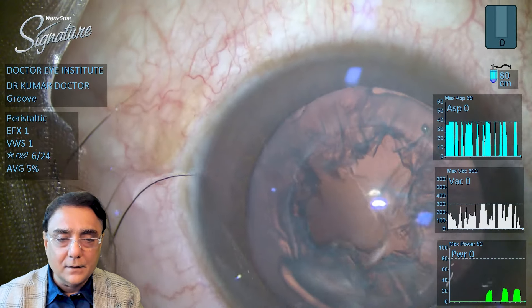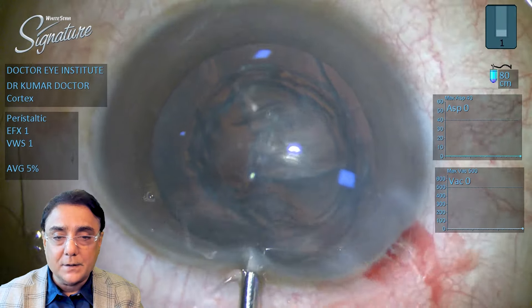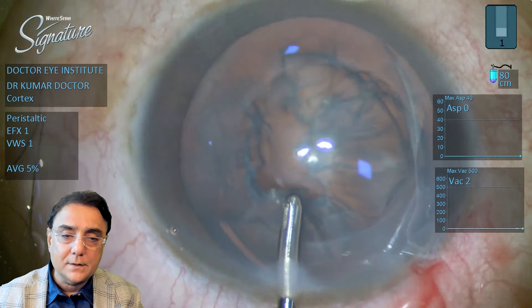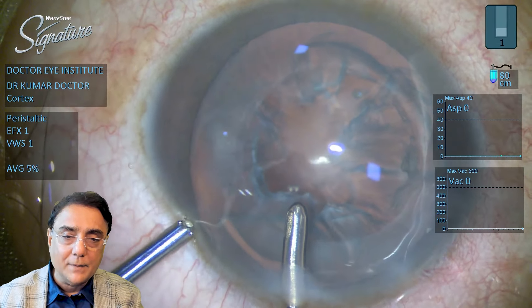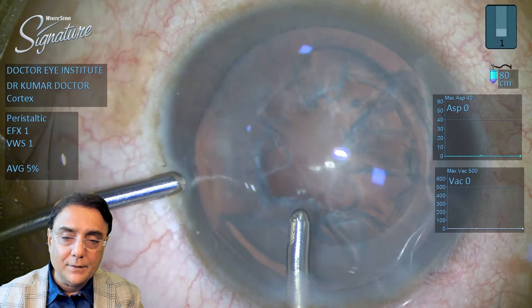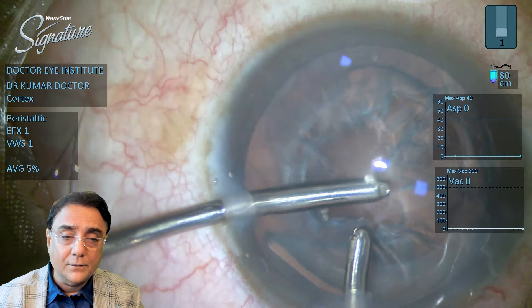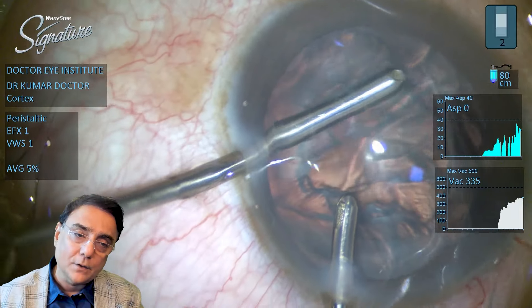Once that is done, one has to go ahead to do the bimanual IA. Don't forget that when a patient undergoes FLACS, there are no free floating cortical fibrils just below the CCC. The cortex is cut 200 to 300 microns below the CCC. That's why when doing bimanual IA after FLACS, there's a special technique where one has to go below the CCC to hold on to the cortex and completely remove it.